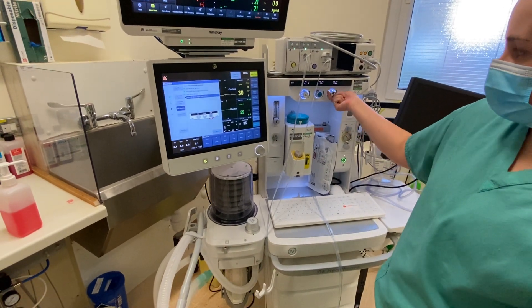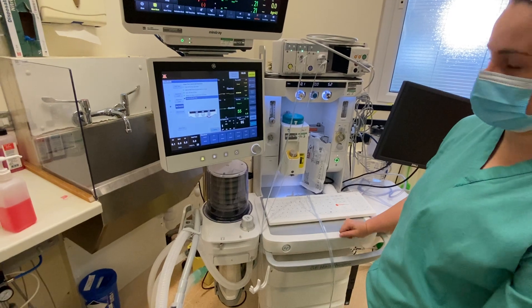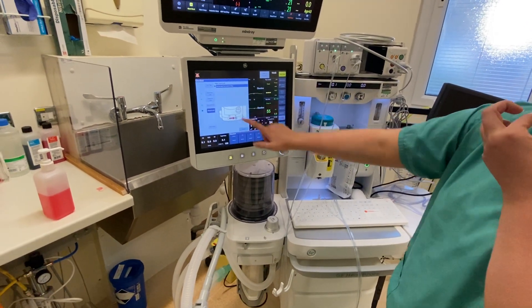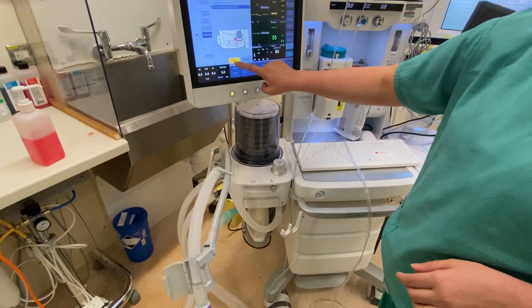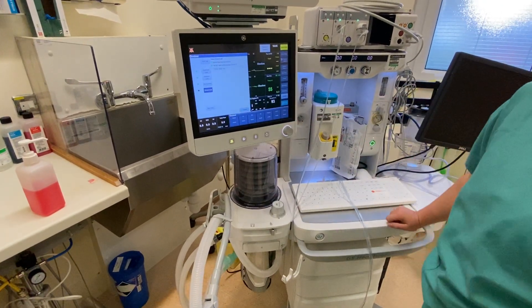And then it will ask me to turn on air over 3 litres to make sure that it's okay. Now it's asking me just to test the circuit leak itself, so that will ask me to turn it on to manual ventilation and change the APL valve between 30 and 70 and press confirm.